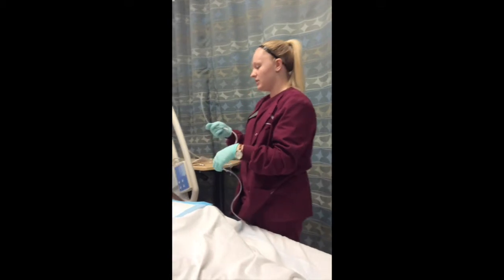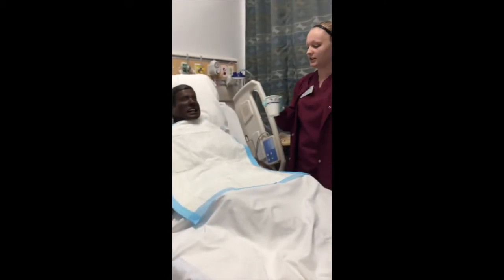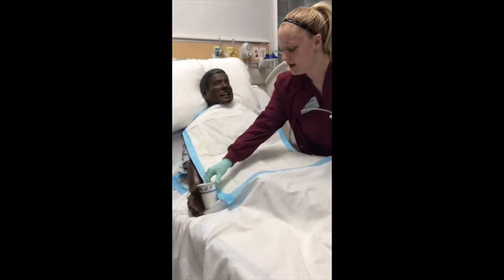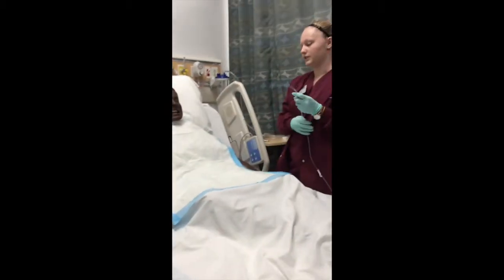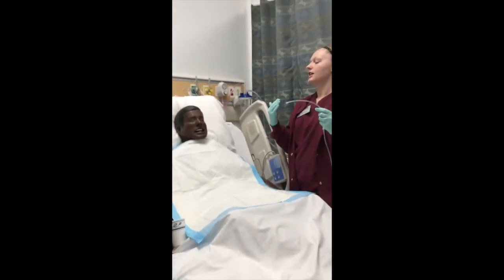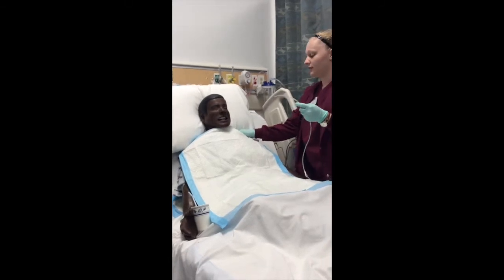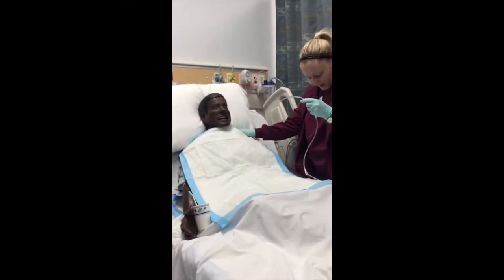So now that I've got it ready, I'm going to tell them that I'm going to start inserting it. I'm going to have them get their cup of water, and they're going to take drinks whenever it's time. I'm going to tell them the first thing I want them to do is tilt their head back just slightly. And I'm going to tell them that whenever I feel resistance, I'm going to have them tuck and swallow.